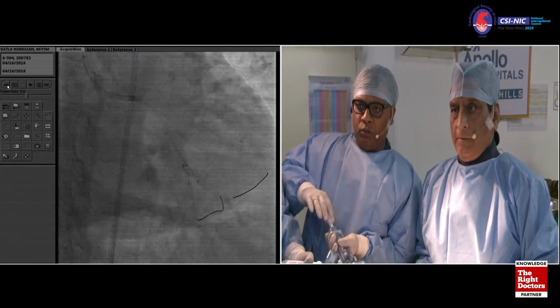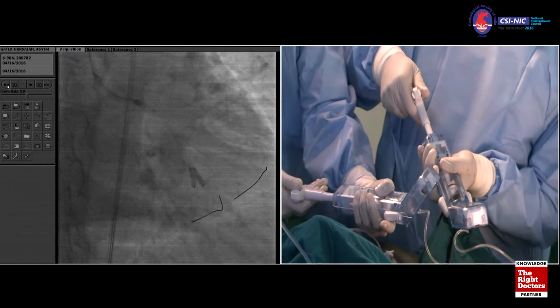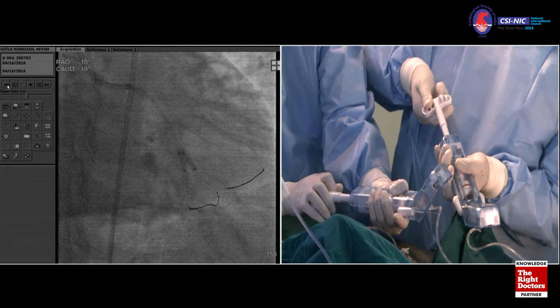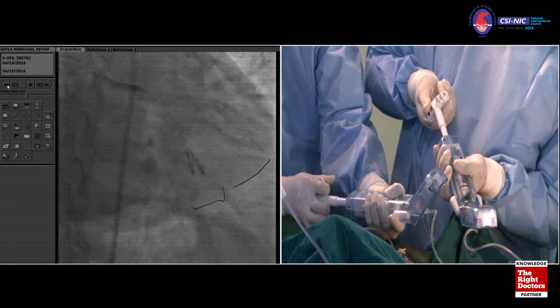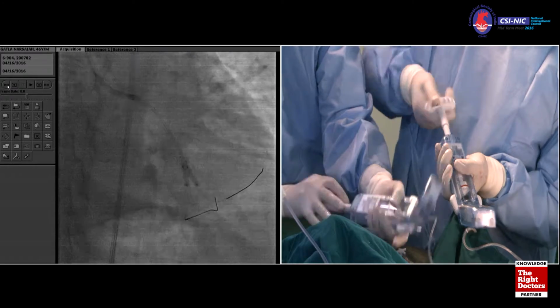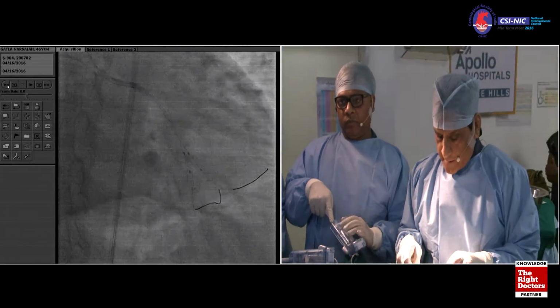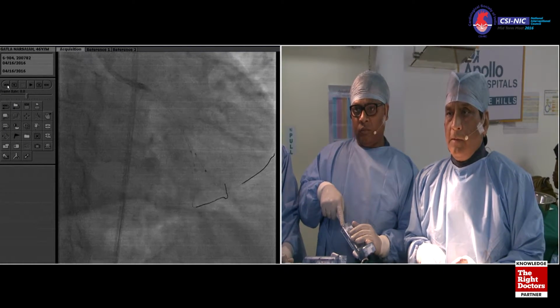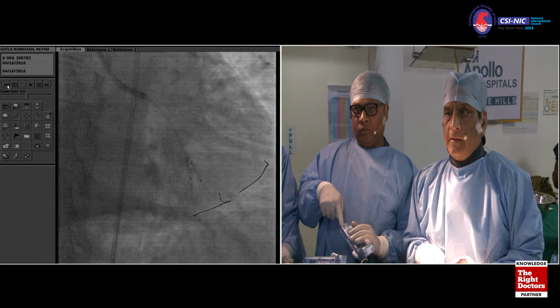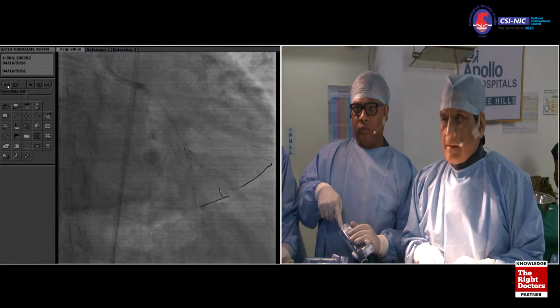Going. 2, 4, 6, 8, 10, 12, 14. Did your balloon slip off distal? No, good, negative. So I'm going to just pull back a little bit proximally and just do one. Before they go to another lab, we wanted to show this, and maybe we can show the final shot, that OCT in the distal end branch. Let me check.